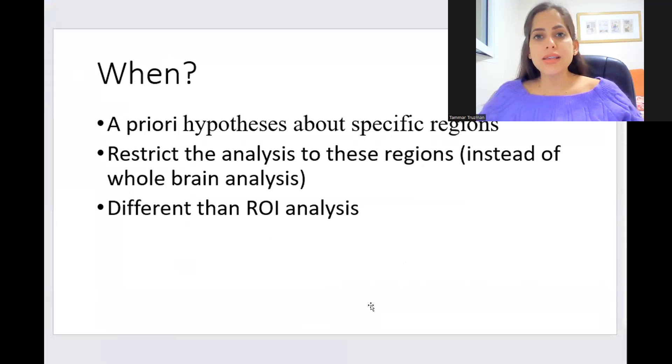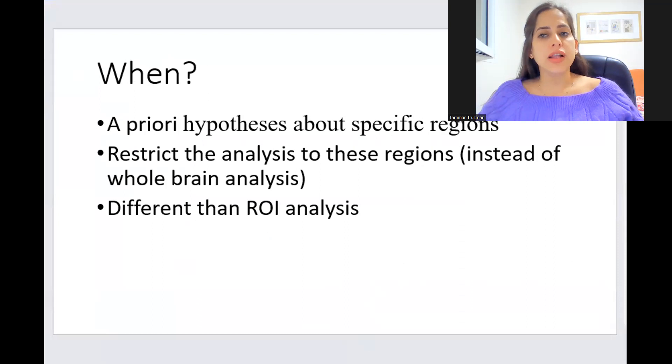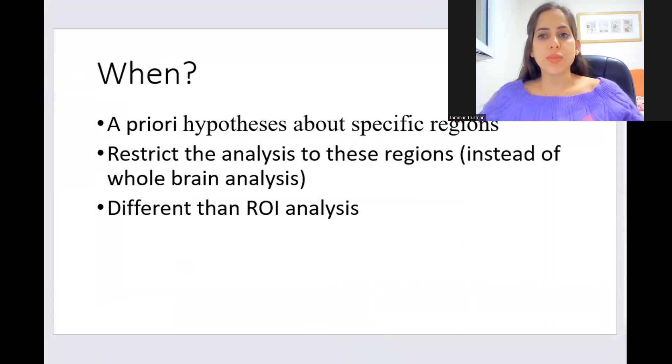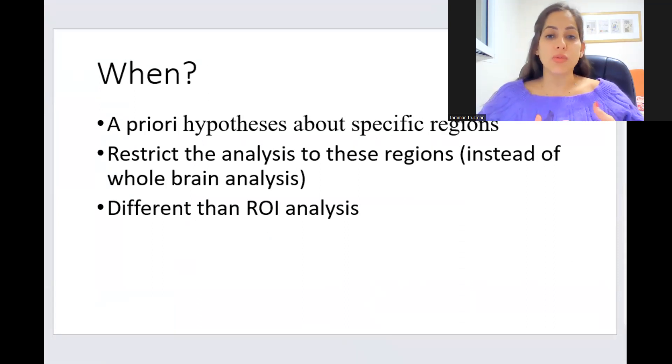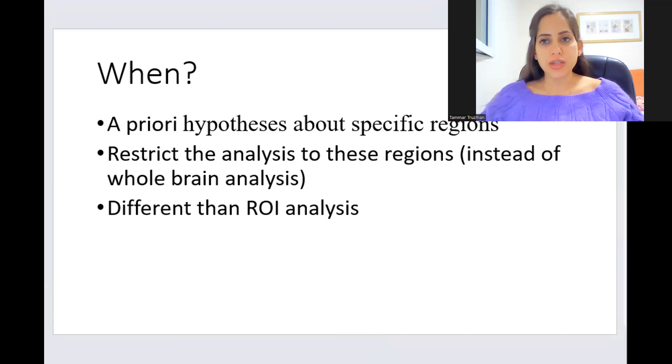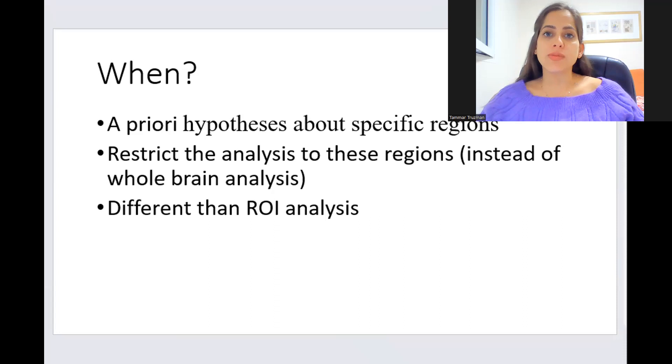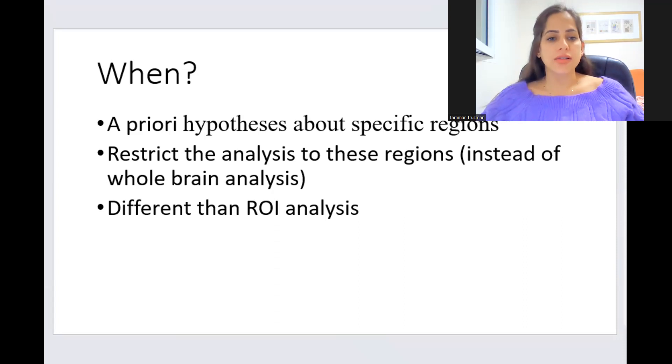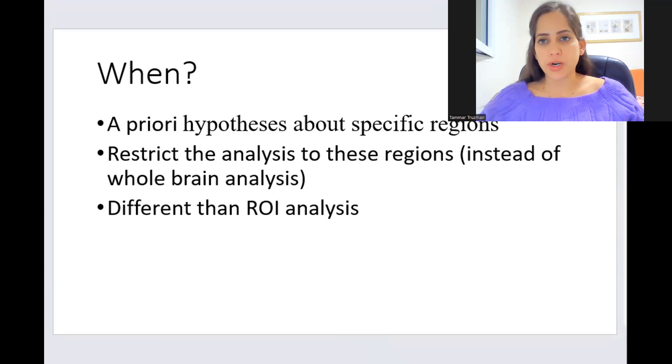It is different than ROI analysis because in ROI analysis what you do is summarizing, usually averaging the results or the data within a region of interest, and we perform some statistical test and end up with a single value for this ROI.